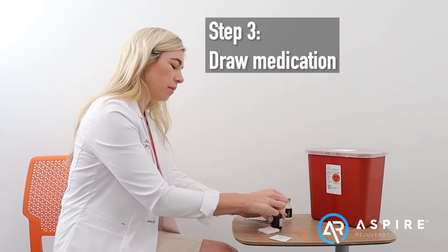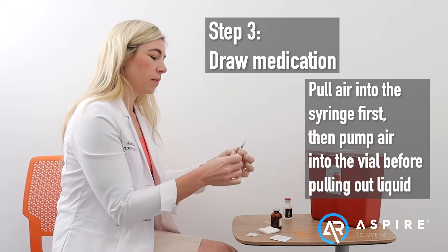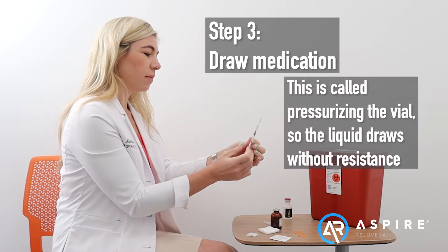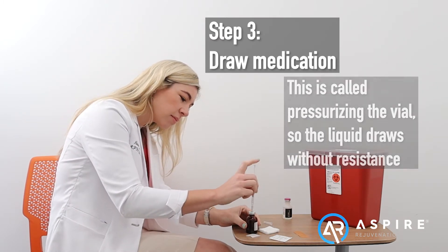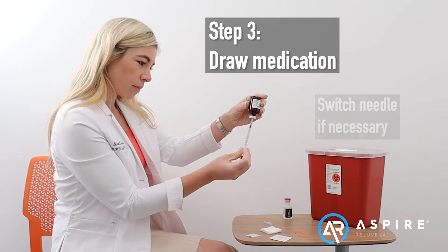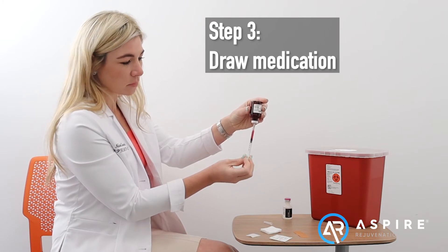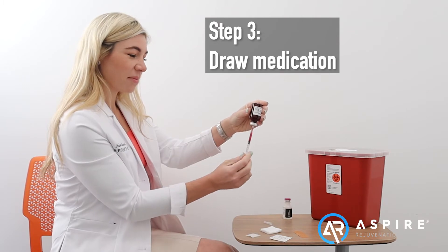Next step, draw the medication. When drawing out medication, draw past the desired amount, and then push up to the desired amount to remove any air bubbles in the syringe.